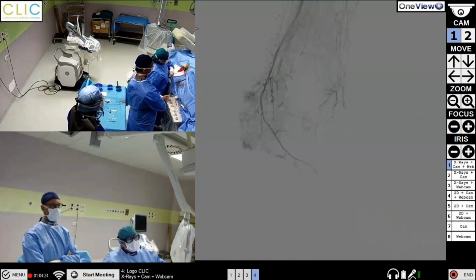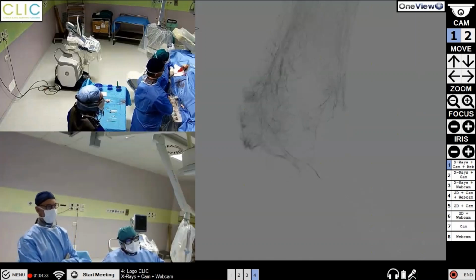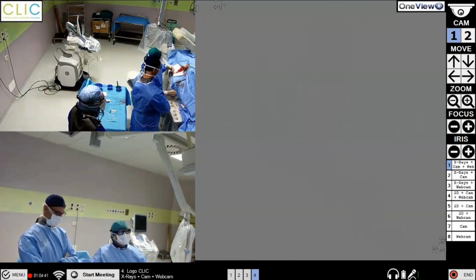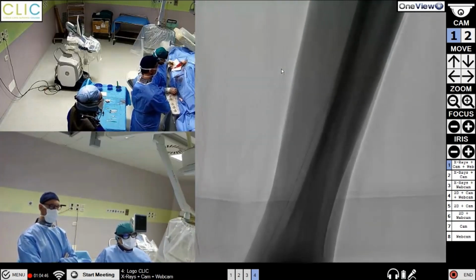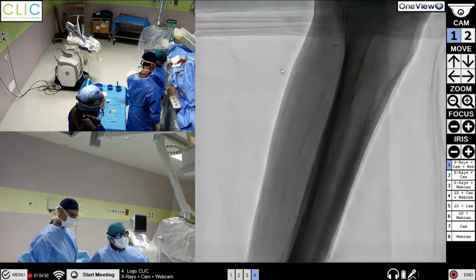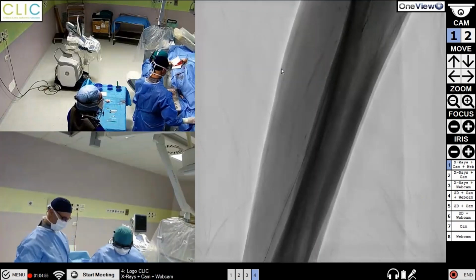Yes, there was a spasm. Yeah, it's not the best foot ever, but there was a spasm. Yes, the forefoot is not existing. No, there is only a blush at the calcaneal area. But well, interesting. Okay. So let me check this area.